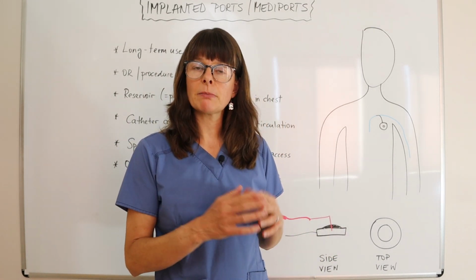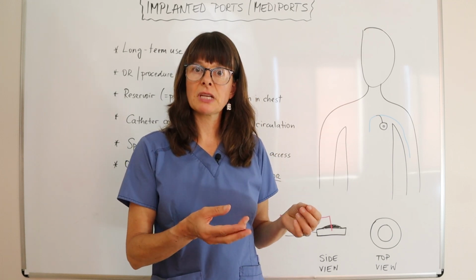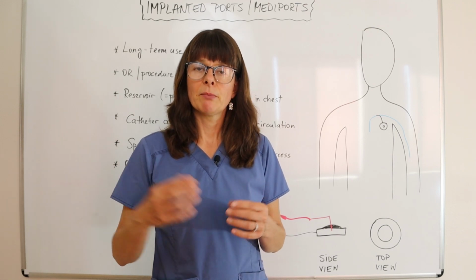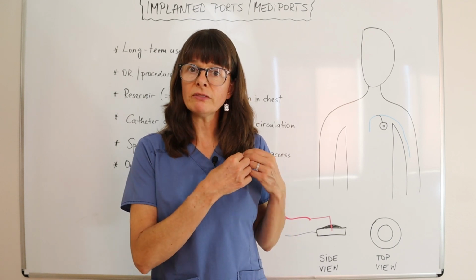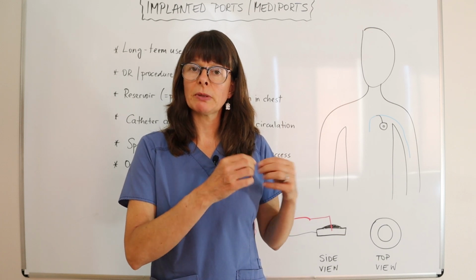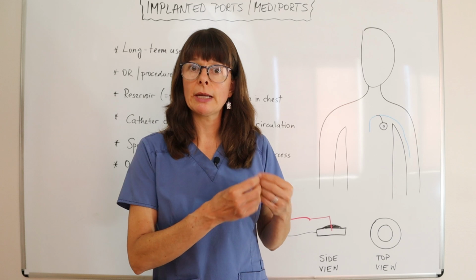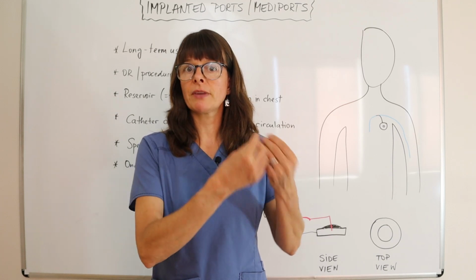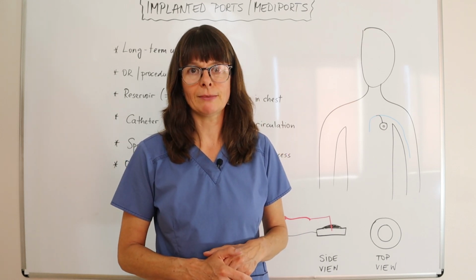It might be the case that a patient who has an implanted port and receives chemotherapy on a regular basis is now admitted for another reason. Because they're already a high-risk infection patient, and because we have that central line access, we might as well use it. But then we have to make sure we follow all the precautions to keep the port going and make sure it doesn't clot off, because otherwise the patient will have to have that port removed and another one inserted for their continuing chemotherapy.